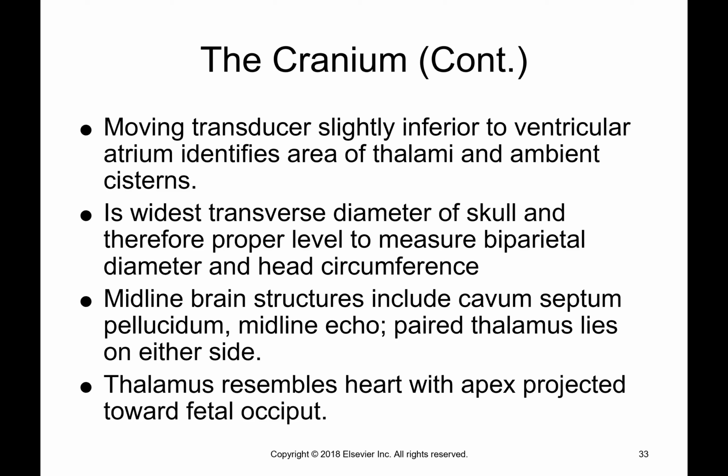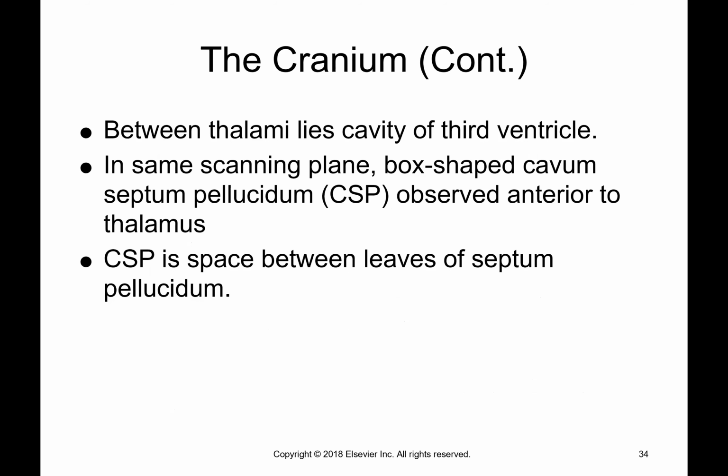After you do that, and you're probably just feeling exhausted already, but we're only at the head, guys. I promise it gets easier. You'll go down towards the thalamus, and you want to look at that and the cavum septum pellucidum. Between the thalami lies the third ventricle.